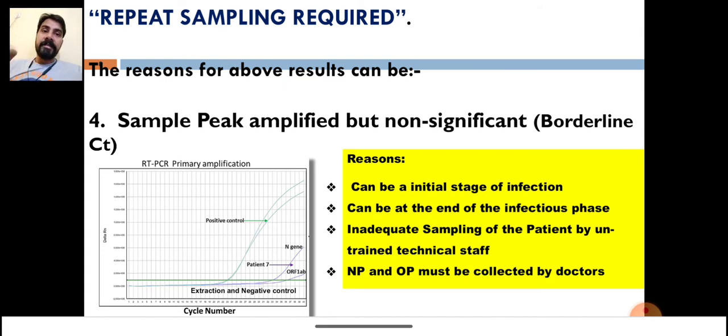What are the reasons for borderline CTs? It might be possible that the technician who is collecting your sample has not collected very well—they just superficially collected the sample, and the actual viral load which needs to be in the sample was not there.